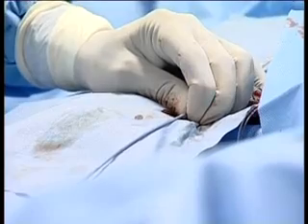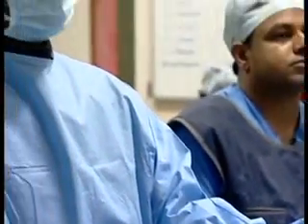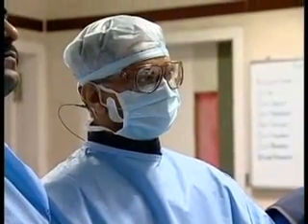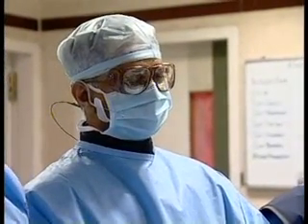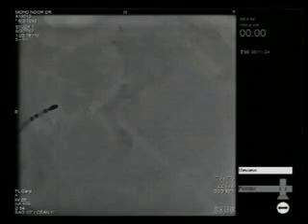Because the sympathetic chains are in circles and in longitudinal, so you have to break it at different points. Is there any way we can assess whether the denervation has been complete or incomplete or partial?